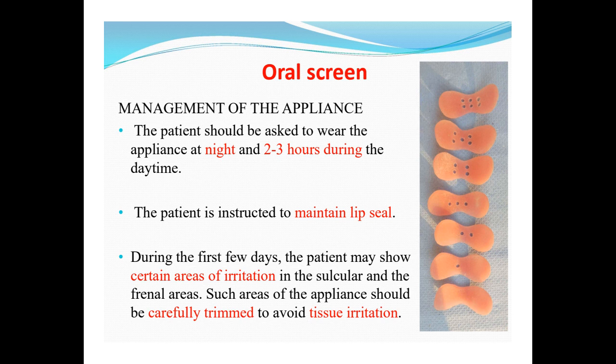The child has to wear the appliance at night and at least 2 to 3 hours during the daytime. The child has to maintain a lip seal, and sometimes the child may complain of tissue irritation, as and when you have to do the trimming of the appliance.